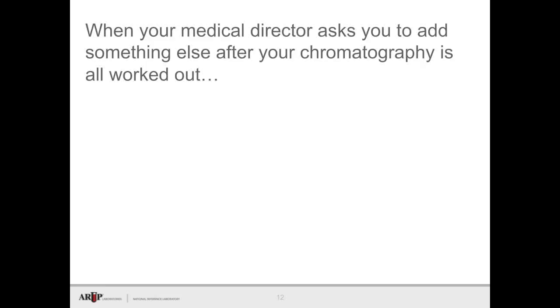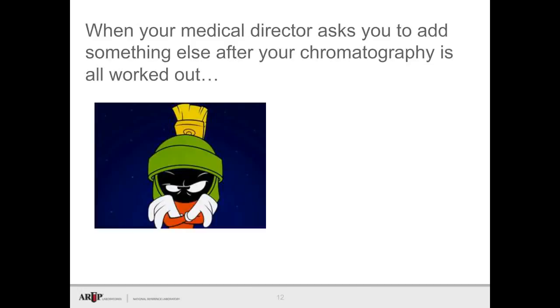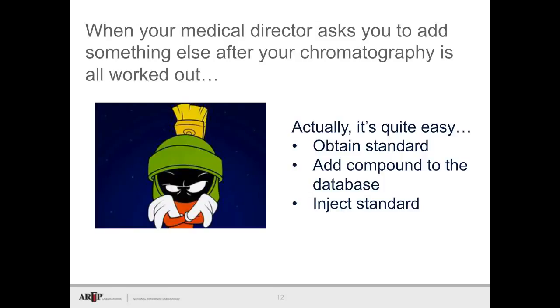So when your medical director asks you to do something else after your chromatography is all worked out, this is probably the face you give them. But actually, it's really easy to add a compound after your method is developed. You add the analyte to your database, inject a standard to get the retention time, and then add it to your stock solution to make sure it plays nicely with everything else. Isn't life nice when you don't have to optimize or de-optimize individual compounds or look for transitions?